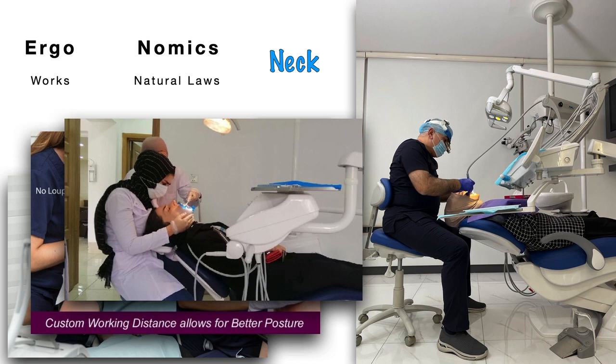But later after I took the picture, because I am head of the department of endodontics in our special center, I told my colleague, you see, you are subjecting yourself to cross infection 100%, and you are bending your posture in a wrong way. I told her that it is normal to share this picture in my lectures. She said yes. So I present this case to show you that many dentists work in this way.